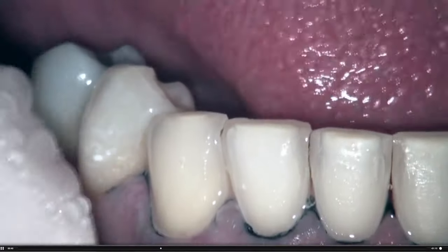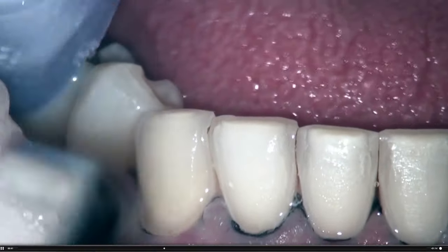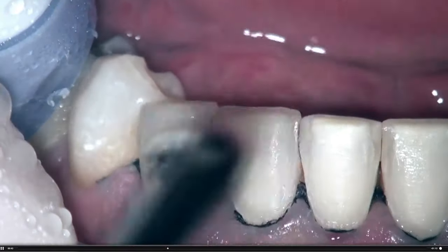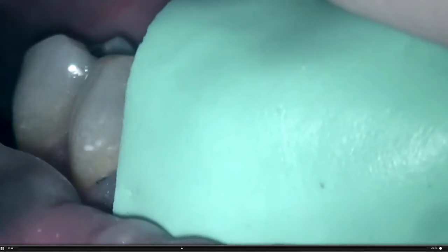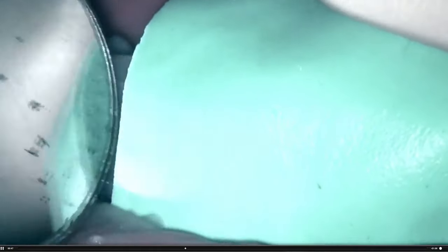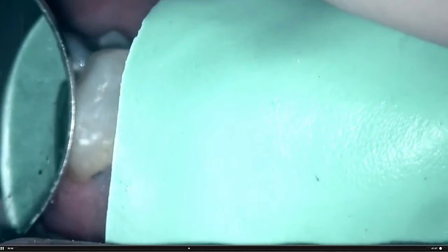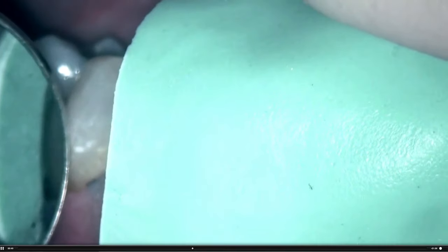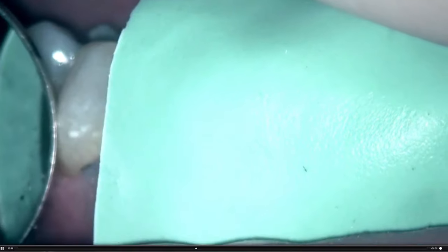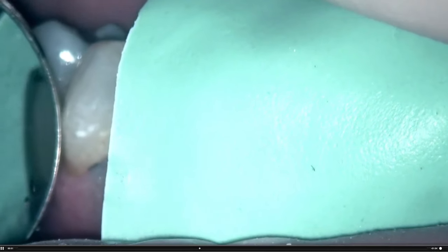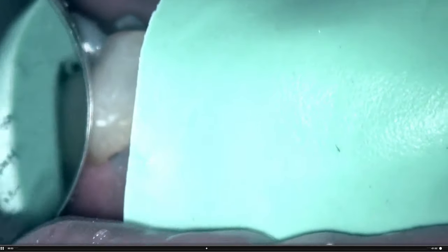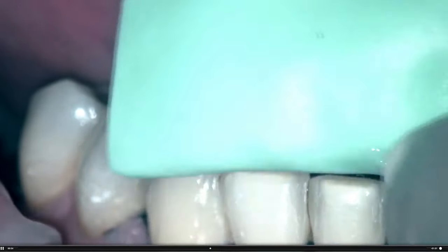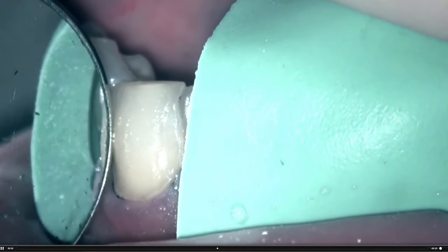It's the end point of the final porcelain veneer, ideally created on the diagnostic wax-up. And here you can see I have reduced this adequately with that little bit of reduction with the large KS diamond.